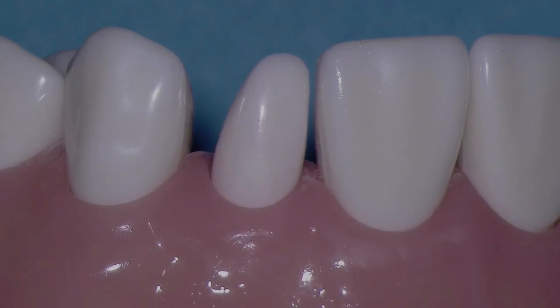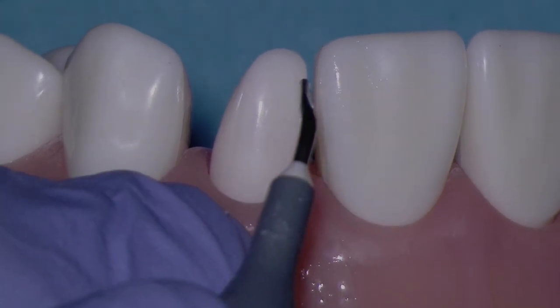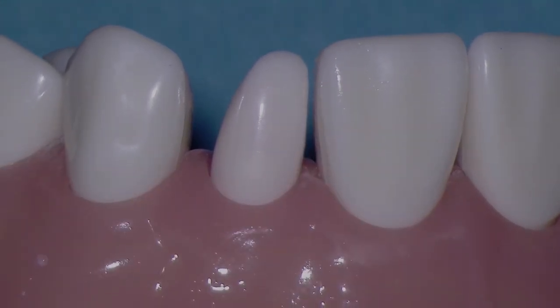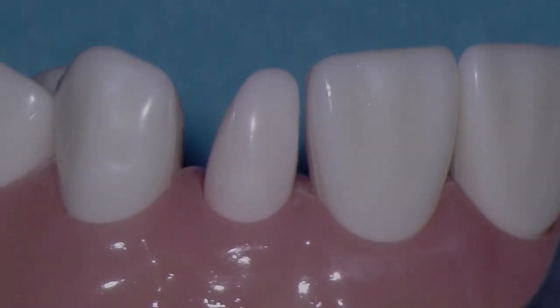We're going to go into the contact area. I want to come in and have this be in the heart of the future contact, both buccolingually and occlusogingivally. And it's going to be about the width of this bent cannula, about 1 to 2 millimeters.